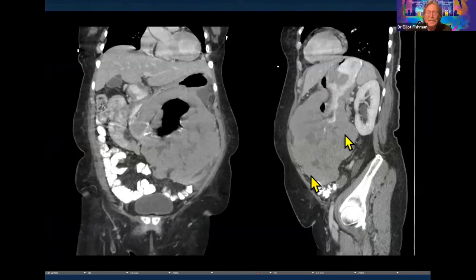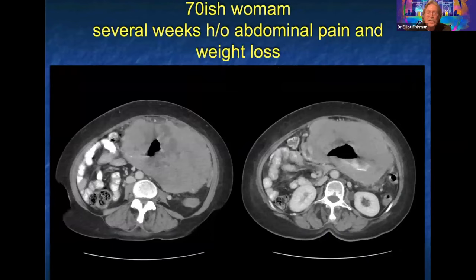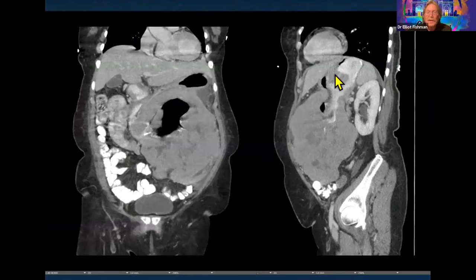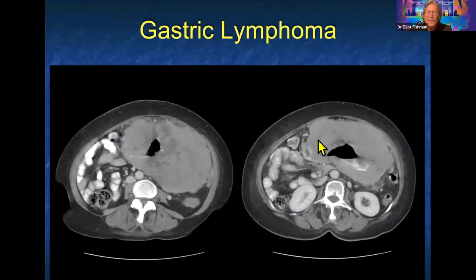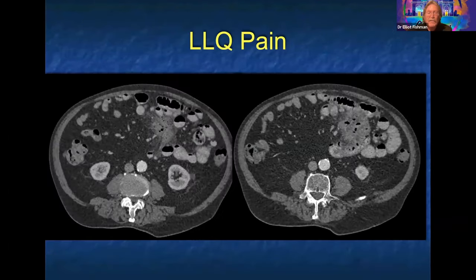Getting away from the cecum — patient with abdominal pain and weight loss. Looks similar but it's more the stomach. Answers mainly GIST and lymphoma. GIST is a good thought — it's a big ulceration in the stomach, and GISTs commonly ulcerate and can be very large. But this was gastric lymphoma. Gastric lymphoma can be very bulky, and this was a really nice example.